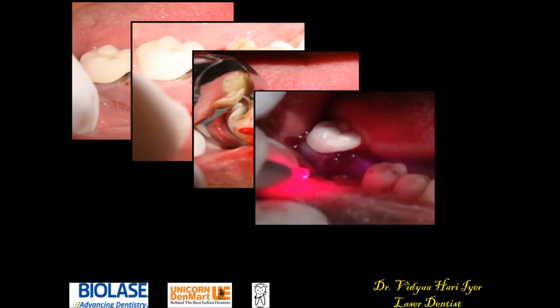Now why a laser in this case? So many times, these are bacteria-loaded areas. So as a laser dentist, I can say lasers are bactericidal, that is, they would kill the bacteria, whereas other procedures are bacteriostatic. Now, what is the difference between cidal and static? Cidal means they will kill the bacteria. Now, that is a very big advantage when you go to a laser dentist, and that is what we promote.